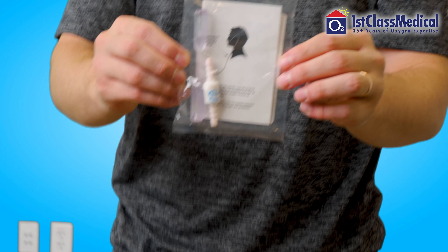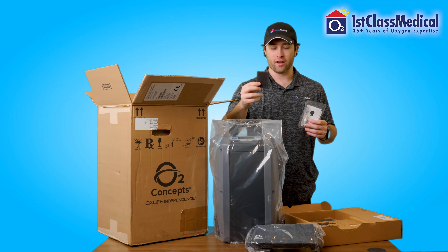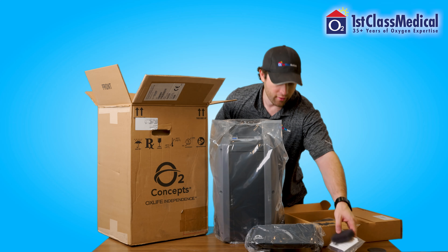You have a little connector here for your cannula. You have an extra filter here for the concentrator itself. These are very simple — just hand wash and air dry when you need to replace that.